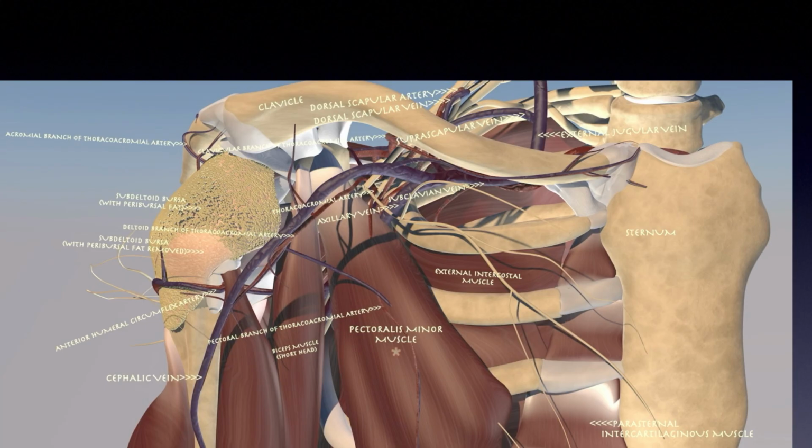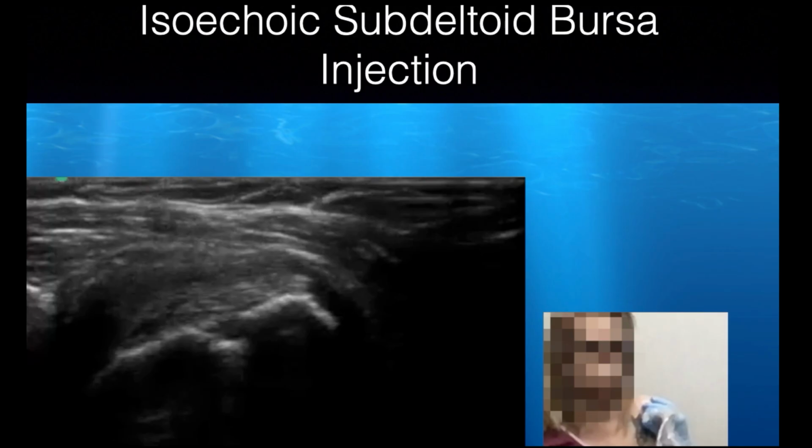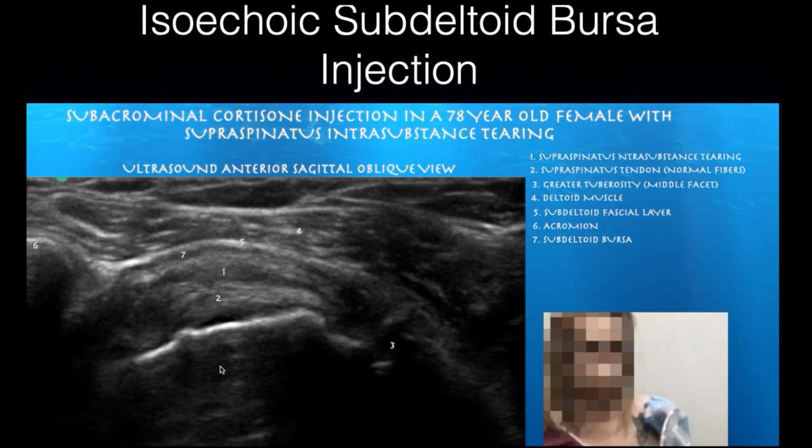All right, so I think that's really the main structures I wanted to go over for anatomy. Okay, so let's just jump into some of the injections. Dr. Jacobson went into all the different anatomy of the structure, so I'll just jump into the actual procedure itself.